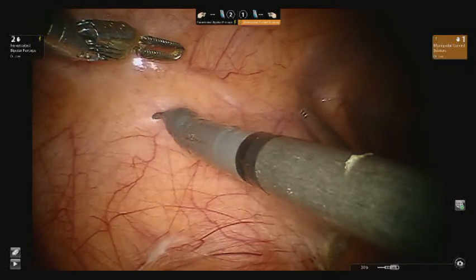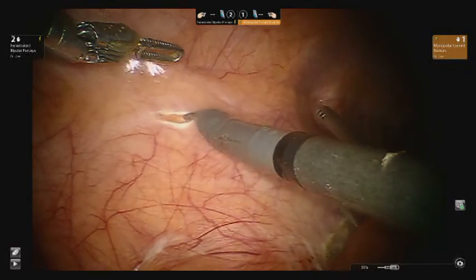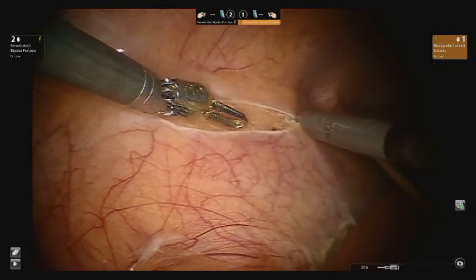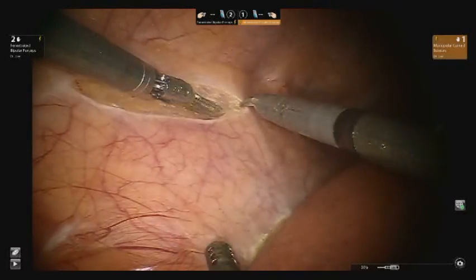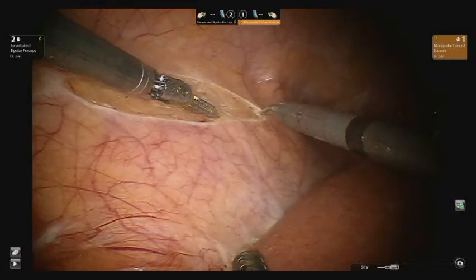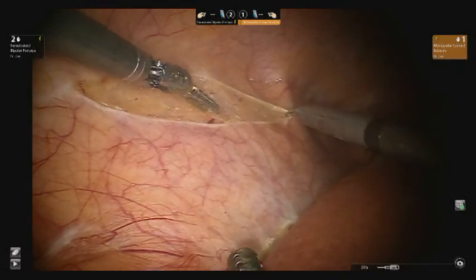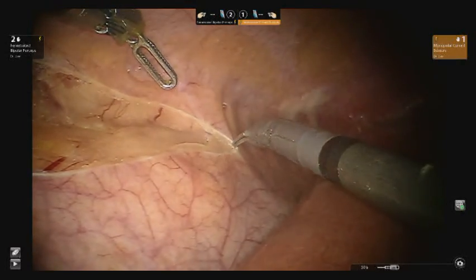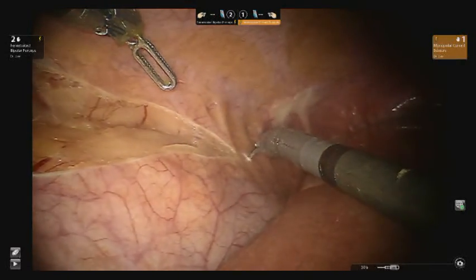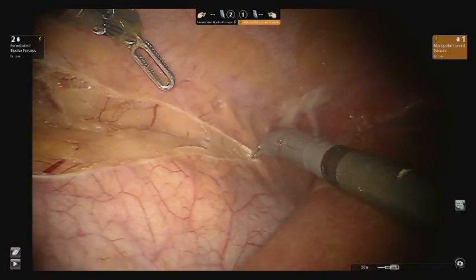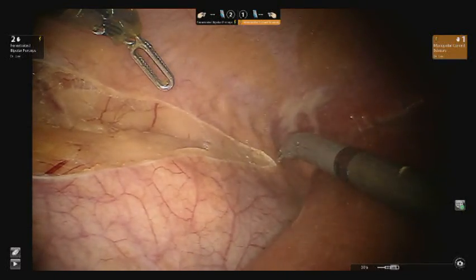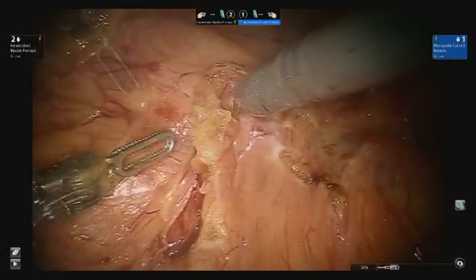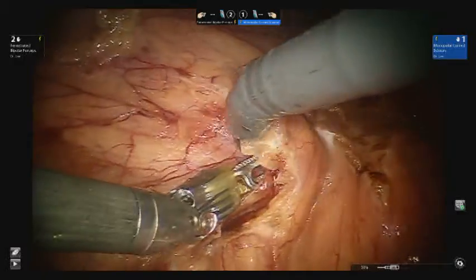Using a monopolar scissor and fenestrated bipolar forceps, the line of Toldt is incised in an avascular plane to mobilize the bowel medially. This incision is extended beyond the superior pole of the kidney, as the kidney will ultimately need to be completely mobilized and flipped due to the posterior location of the tumor.